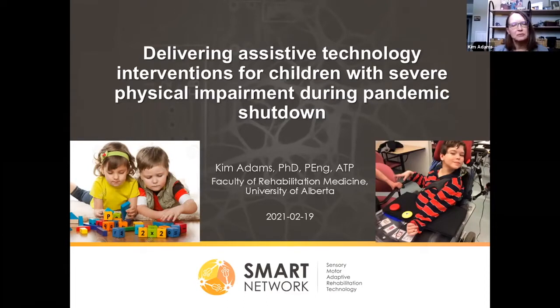Well, when a child has a disability, like this fellow on the right, their opportunities for play and learning are more limited. He can't go where the toys and the learning activities are on his own necessarily, this fella, because he has a manual wheelchair. Someone has to push him there. His functional range of motion is here around his lap tray and his head switch.